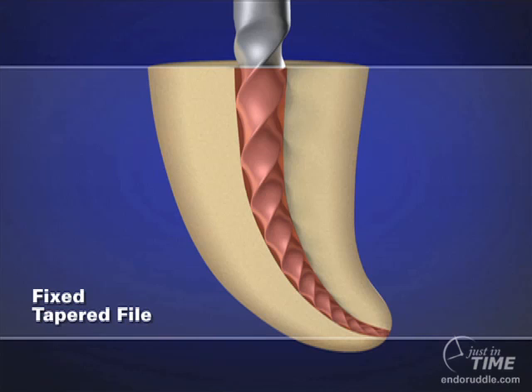So various manufacturers have done different machining concepts to mitigate taper lock, and you can find these in the various systems. But all instruments except for ProTaper and Wave 1 have fixed tapers. The problem then with fixed tapers is the screw effect, taper lock, and it usually takes quite a few instruments to impart the desired shape.